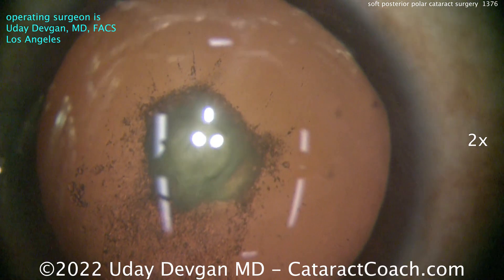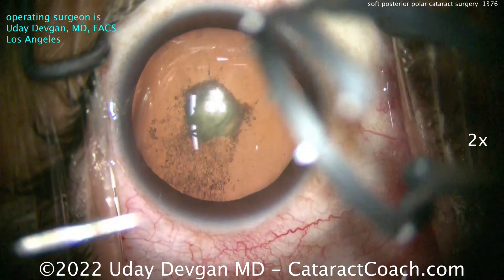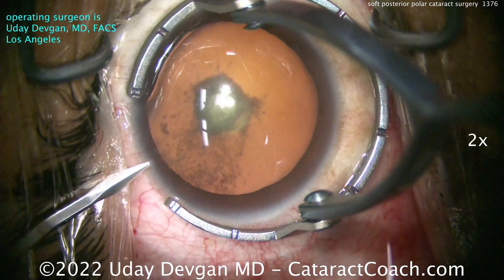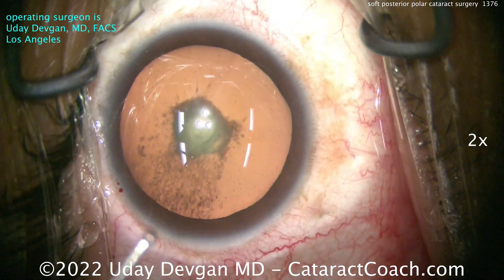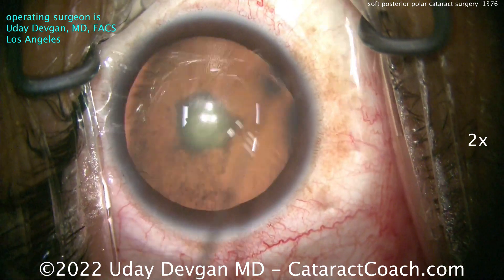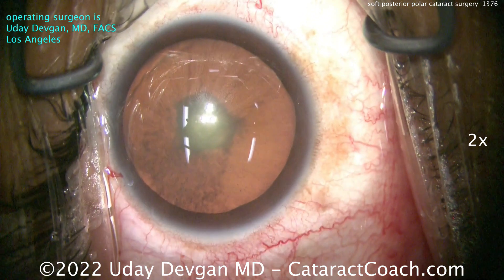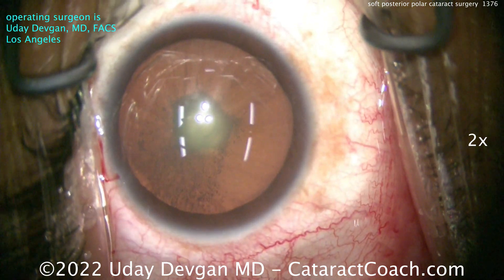This is me operating again. All these cases this week have been me doing surgery, and all these patients were from one single day in my operating room, so I get a beautiful variety of interesting cases here. The video is shown at two times normal speed — it's about four and a half minutes, so the case took me about nine minutes. There's that red reflex.